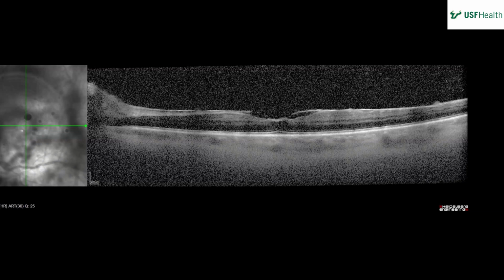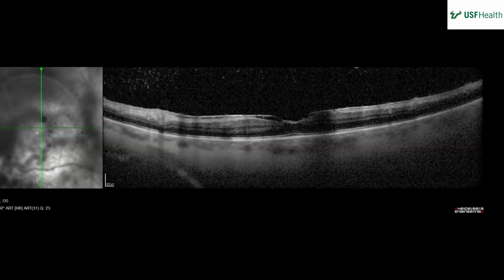Yeah, I thought the retinal layers were pretty well organized, not disrupted. Pretty good. There's no macular edema. With most of these inflamed eyes, presuming it's inflammation, you're mostly looking to make sure it's not macular edema. And then the rest of it's just sort of funny looking.